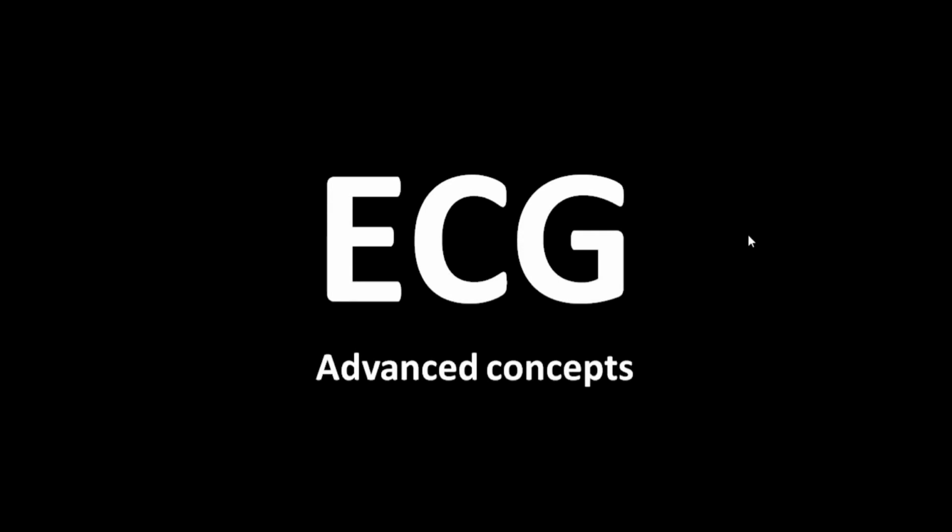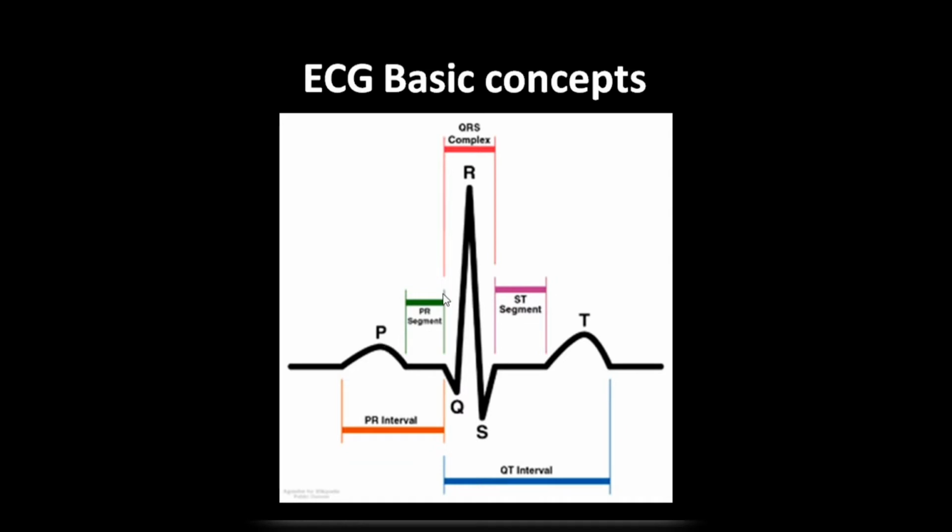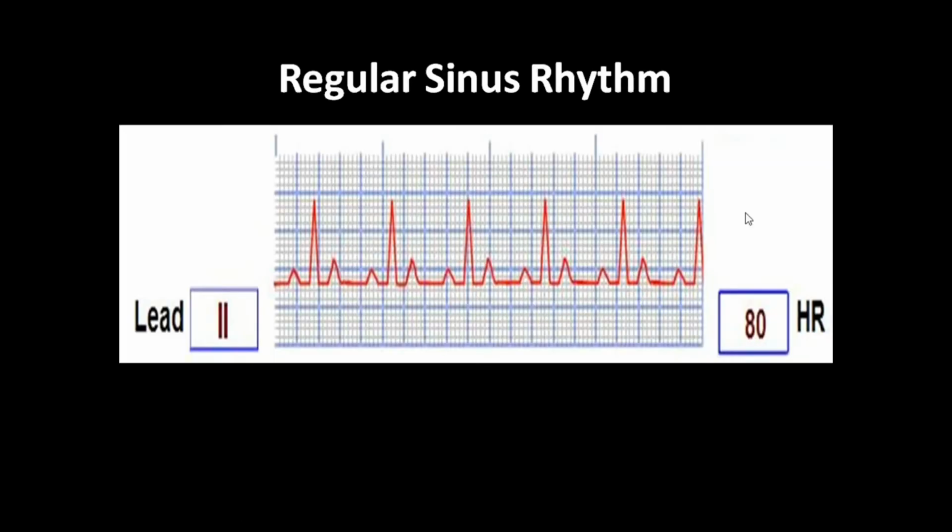There are many basic concepts in ECG which I have dealt with in my previous video. If you have not seen that video, please check my YouTube channel, where the basic concepts of each of these ECG waves and how to interpret them are clearly dealt with. So let's move on to read the ECG by interpreting the advanced concepts in ECG waves.